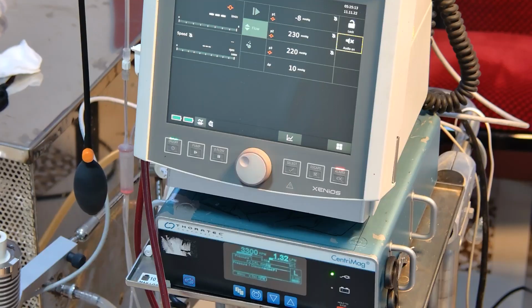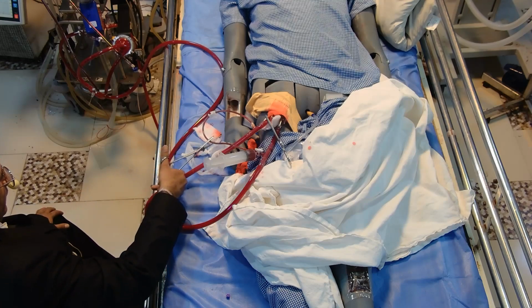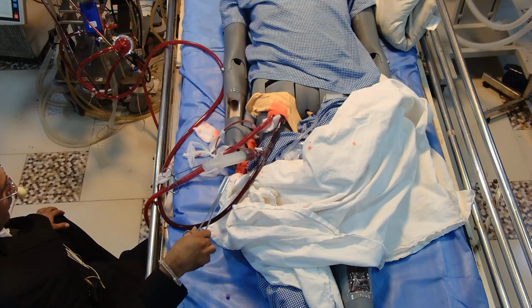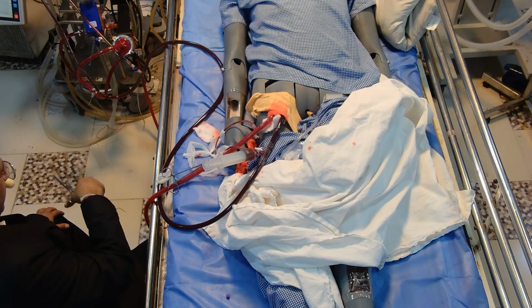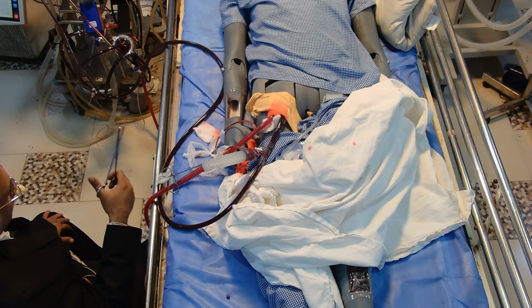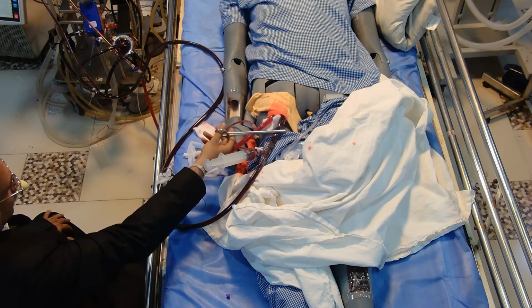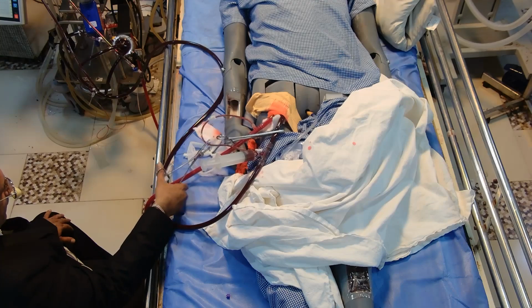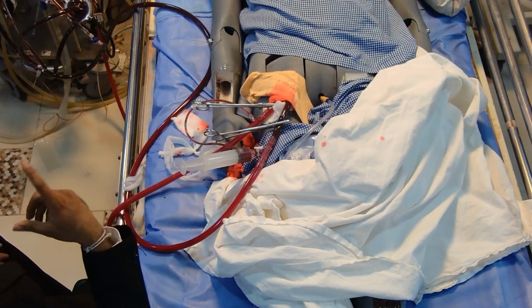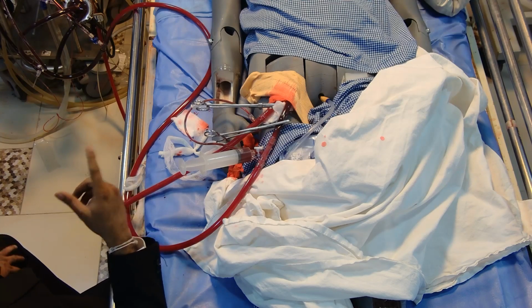So release the venous clamp first. Okay. Clamp the bridge and release the arterial clamp last. Okay. So now the blood is coming from the vein and going back to the artery. Wait for 15-20 seconds so that whatever blood has accumulated in the cannula is washed off. Again, put a clamp on the vein, release the bridge and put a clamp on the artery. And you have to keep on doing these steps repeatedly for almost 1 hour, every 10 minutes.